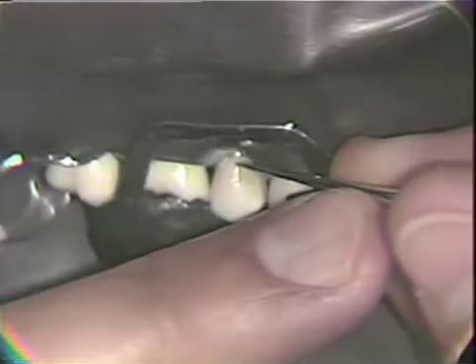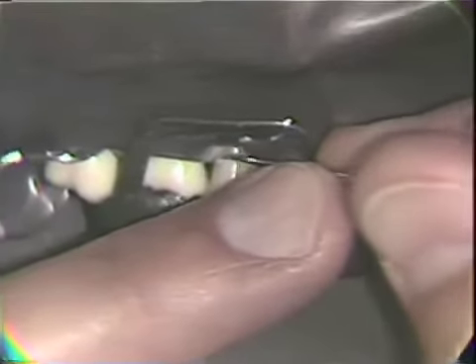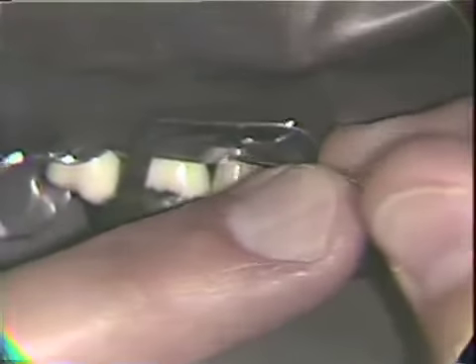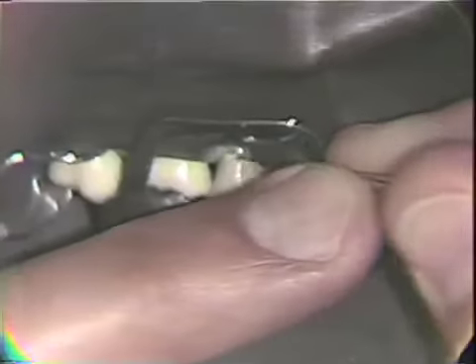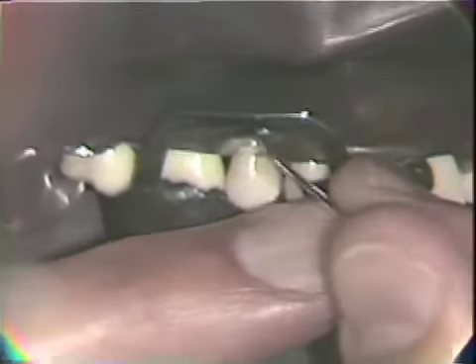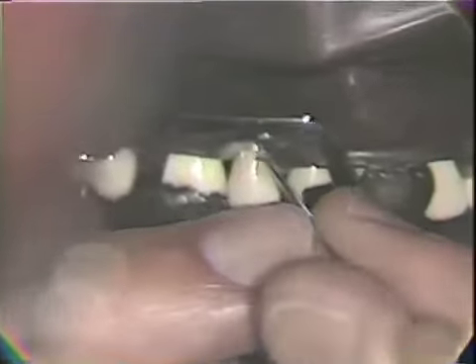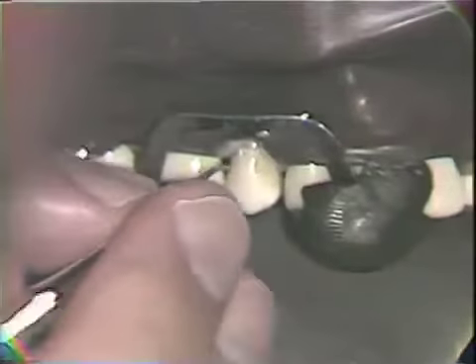All right, we move now to a 6.5, 2.5, 9, which is a bin angle chisel. You can use that to plane off that axial portion. We've really removed all caries at this time. We want to establish just a wall against which we can establish good condensation, working towards sharpness to internal line angles of the preparation.